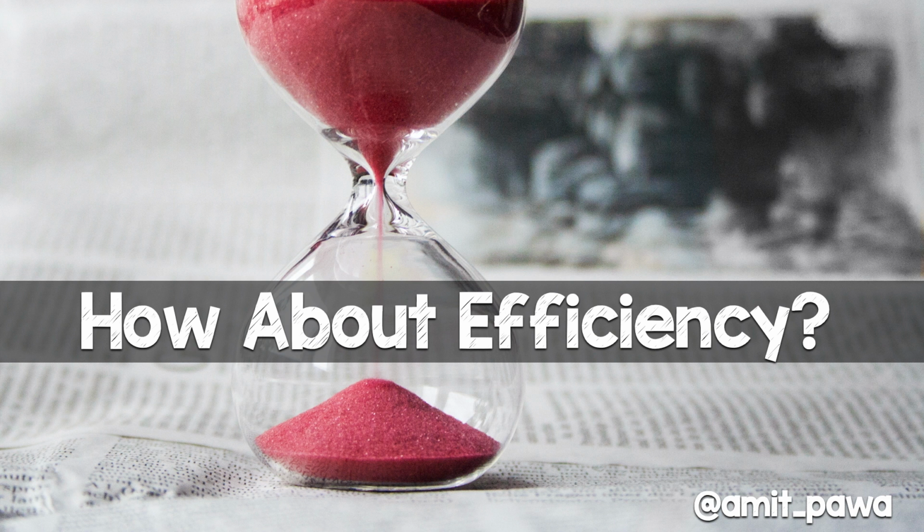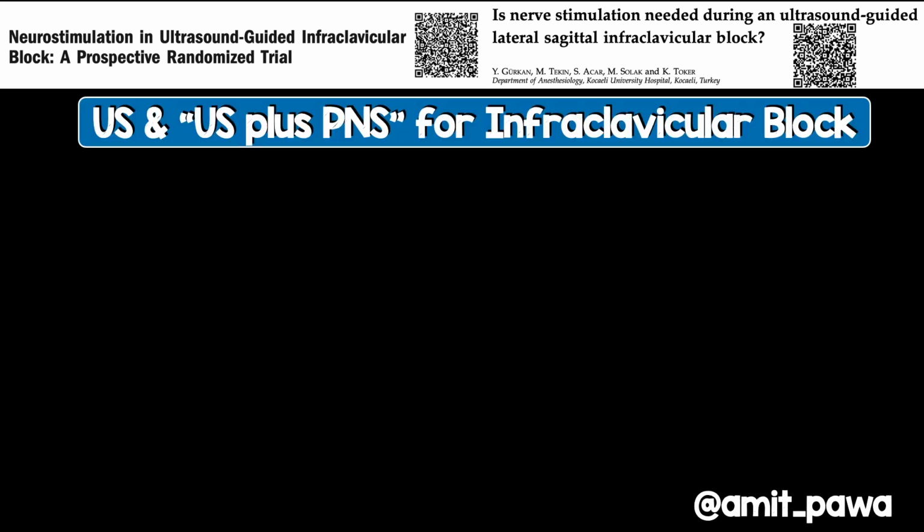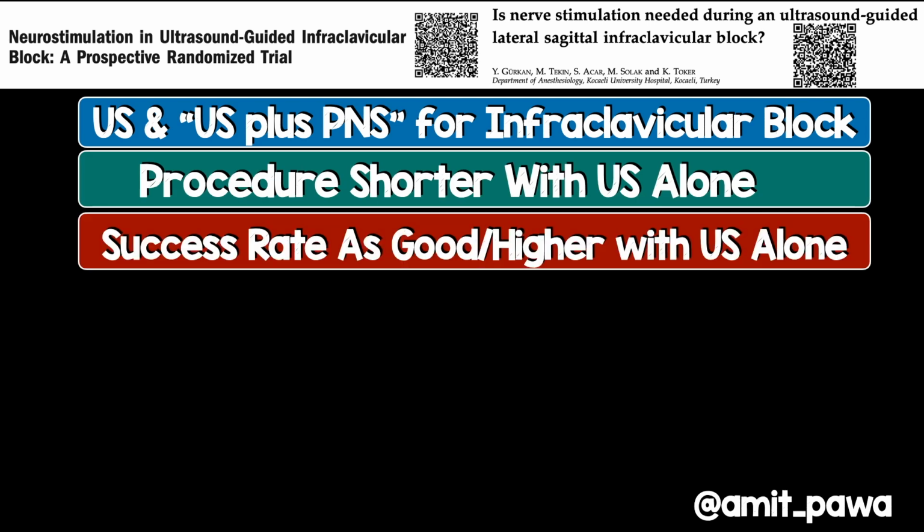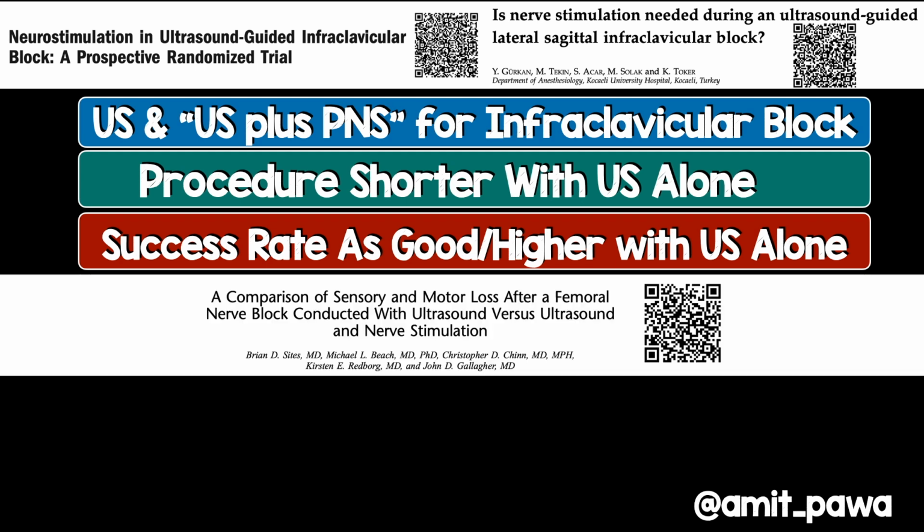So what about efficiency? This is something people often worry about. If you're using multiple pieces of kit, does it slow things down? Well, in these two studies looking at infraclavicular blocks, they were able to determine that when they used ultrasound and ultrasound plus peripheral nerve stimulation, the procedure time was much shorter when using ultrasound alone, and actually the success rate was as good, if not higher, when using ultrasound alone. So why would you want to combine the two?